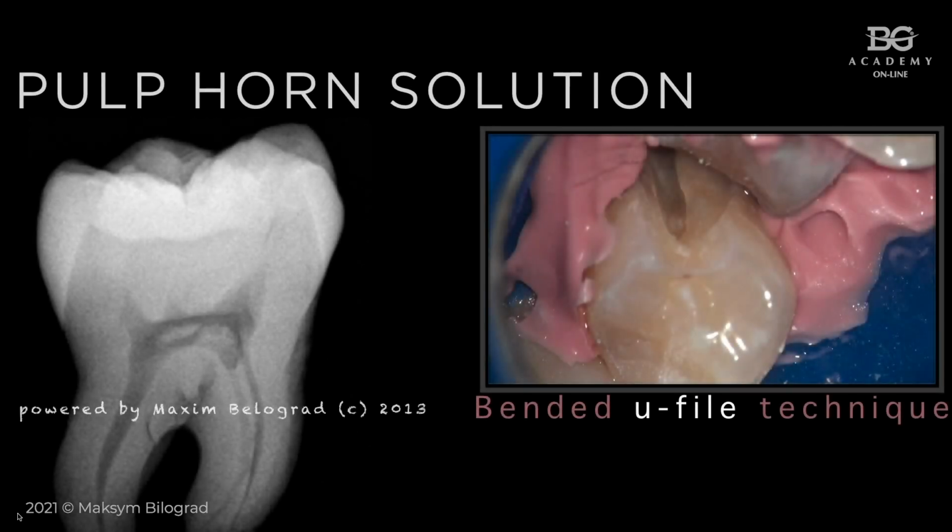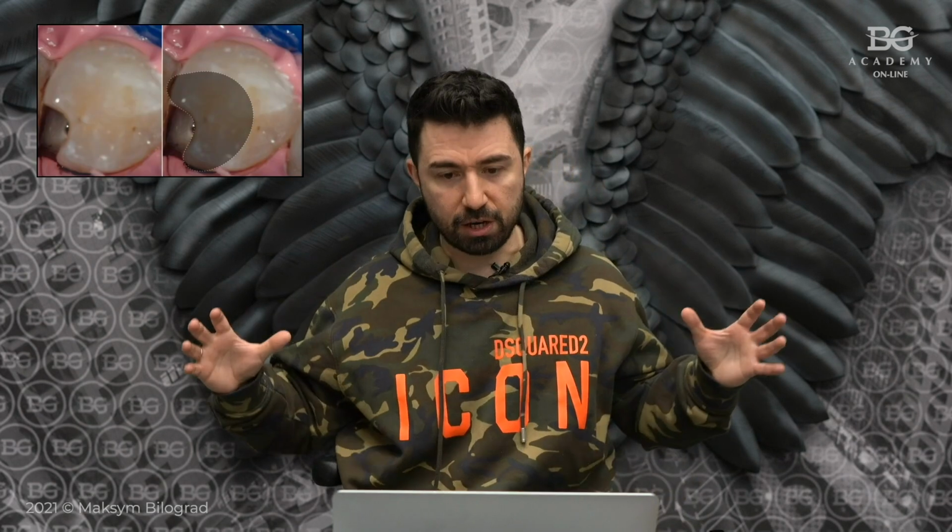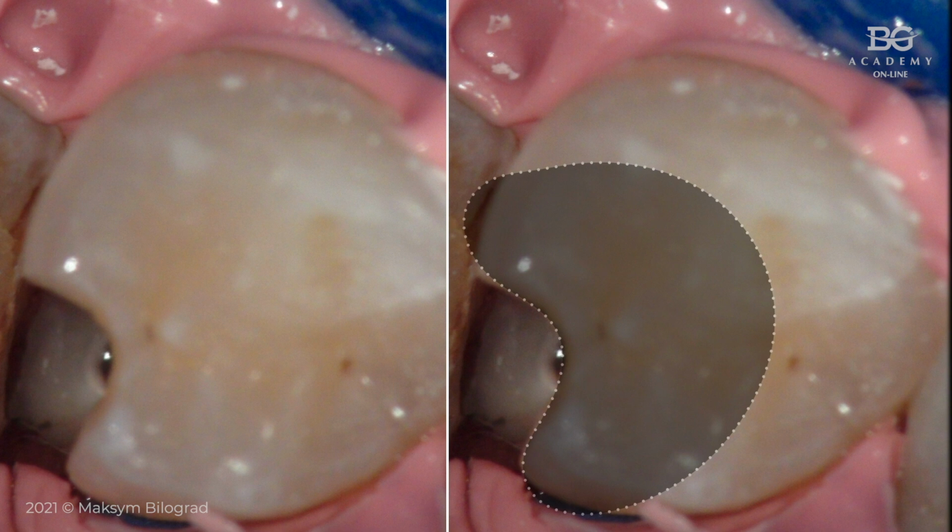And a few tips now for the case at all. So first, the minimal invasive access. I'm not a very good supporter of such a ninja access in all cases, okay? Sometimes we have to, like in this case we had to do the conservative access, otherwise we will end up with destruction, like here. From the left picture you can see our access, from the right side just a simulation if we would do a straight line, let's say.